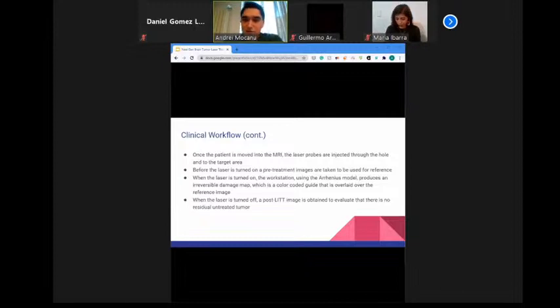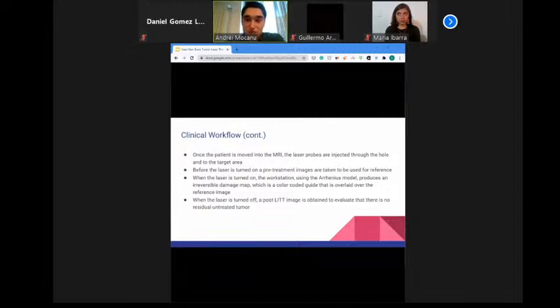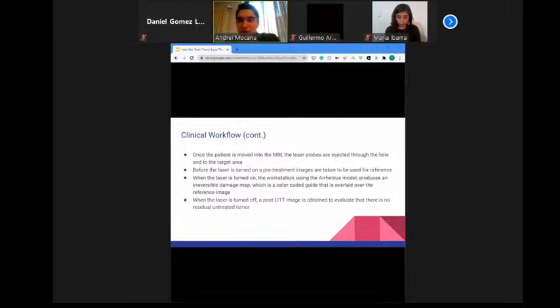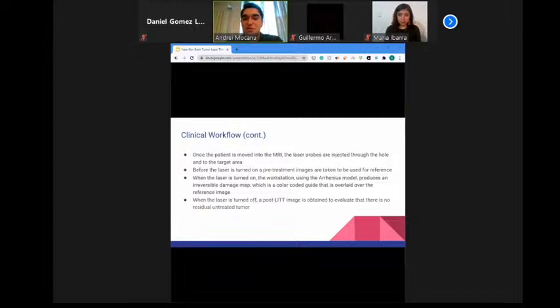Thermal imaging uses a fast-spoiled gradient recalled echo sequence, run repeatedly during ablation. The acquired images are compared with reference images at the workstation and generate color-coded thermal maps using the Arrhenius or CEM43 model. Based on ablation time and temperature, the workstation generates an irreversible damage estimate overlaid on the reference image. The laser is stopped when the estimated irreversible damage extends to include the desired ablation area, after which post-LITT subtraction and DCE perfusion scans are obtained to evaluate the extent of ablation.